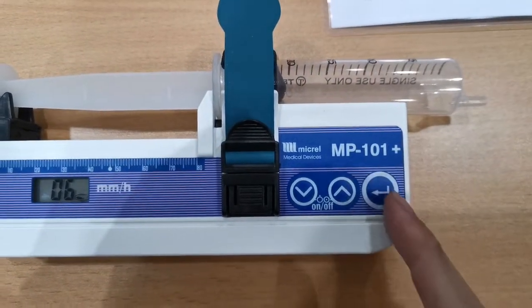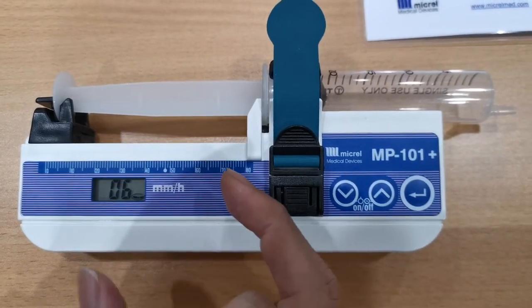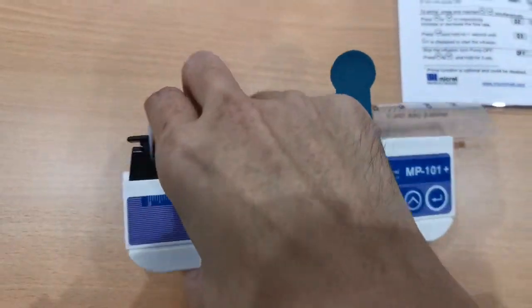Then they have an on and off button. It's for adjusting the time for the syringe to be infused. The enter button. That's the front of it.